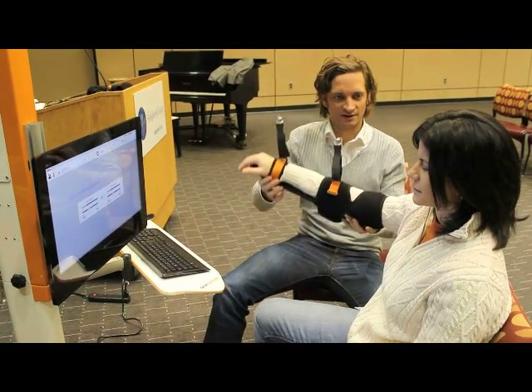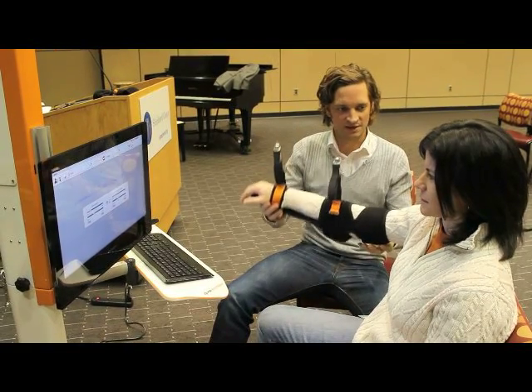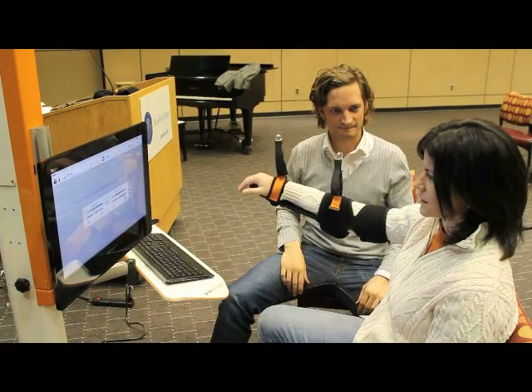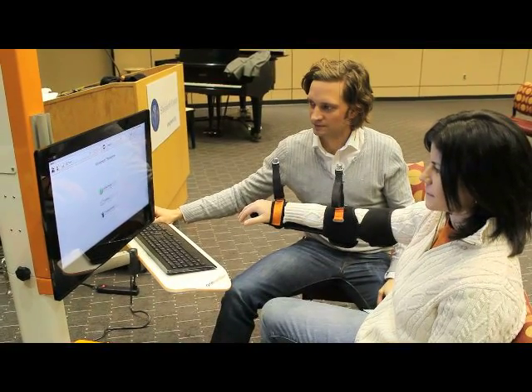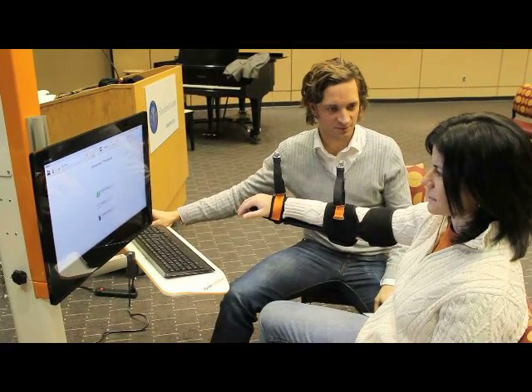Even in a lower position or an upper position, it's holding this same kind of weight support. So from this point on, we can do all kinds of exercises or therapies that we want.